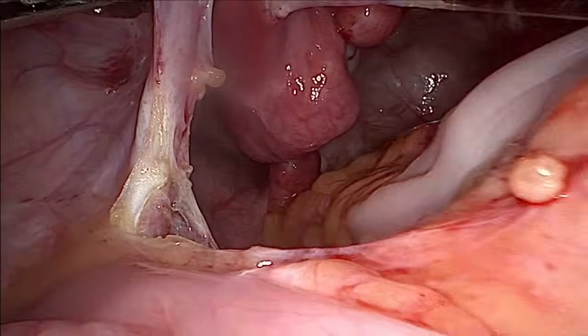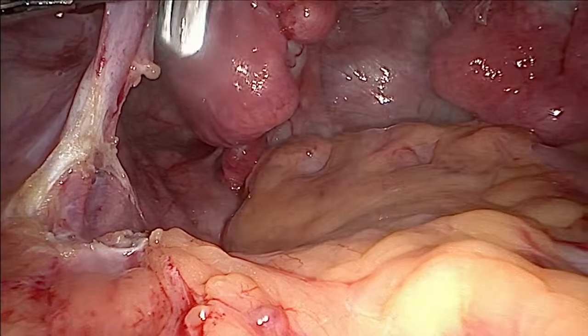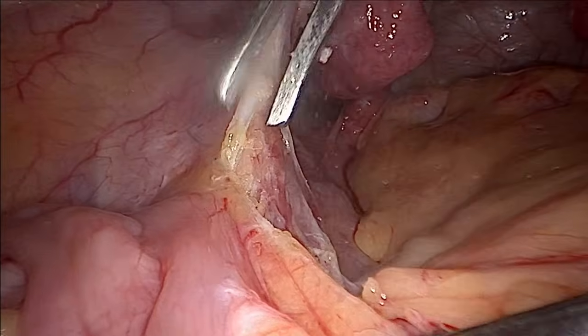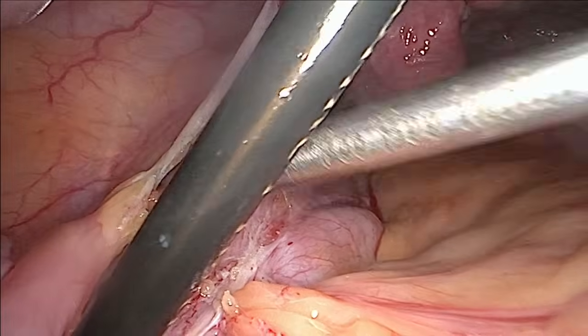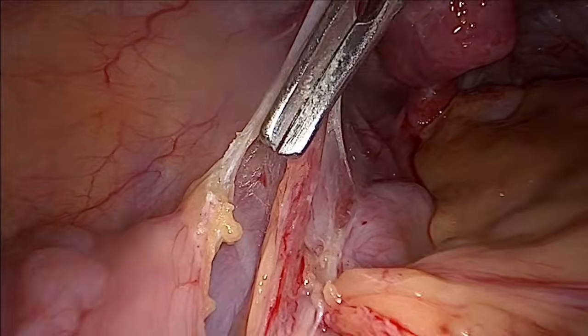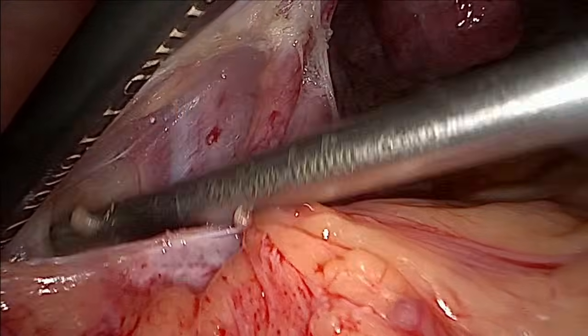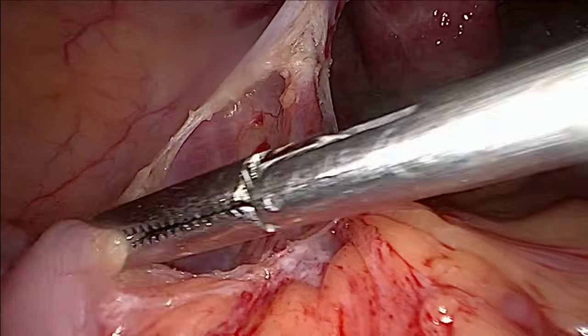Try to mobilize this. Yes, so now you can see I have gone retroperitoneum and actually you can see the ureter, but I would like to mobilize this a bit more. Actually I am in the retroperitoneum, but it's fine as long as you mobilize the sigmoid here.